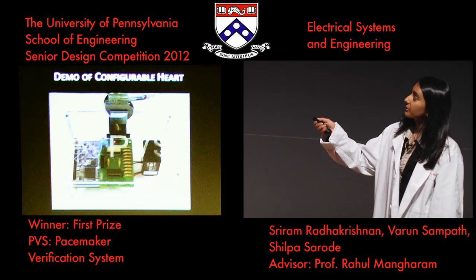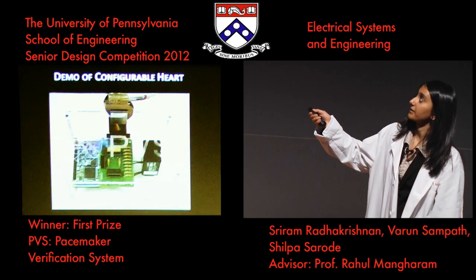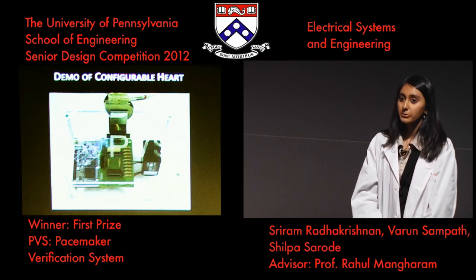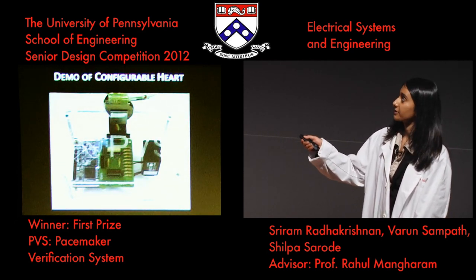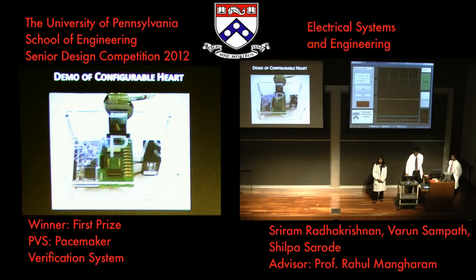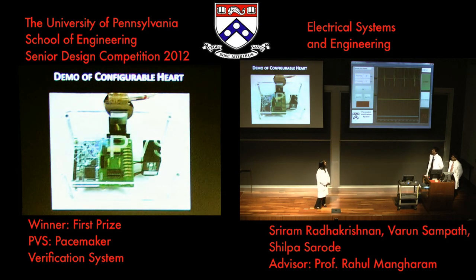Our heart is connected through an interfacing circuit to a real pacemaker. For the purposes of this first demonstration, the heart. Now, once we have a heart on hardware, we can then interface it with a real pacemaker to observe its interaction. So over here, you see the user interface. Now, in our next step, we'll see exactly how the pacemaker and the heart can talk to each other.